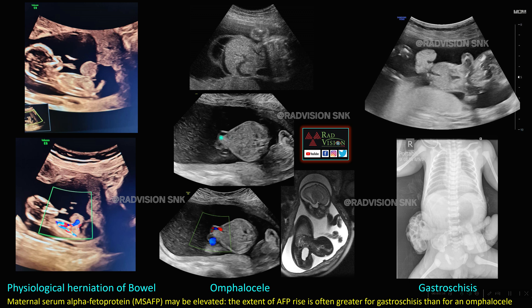Here you can see herniation of bowel loops through a defect with a membrane surrounding it, and the umbilical cord is inserted into it — this is classically omphalocele. In the other case, there is also herniation mimicking omphalocele but with no membrane and no umbilical cord insertion, and it is typically on the right side — this is gastroschisis. Remember: maternal serum alpha-fetoprotein may be elevated, and the extent of AFP rise is often greater for gastroschisis than for omphalocele. Another differential is prune belly syndrome.